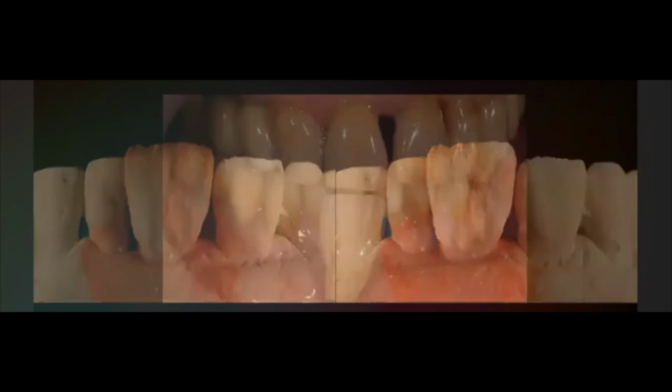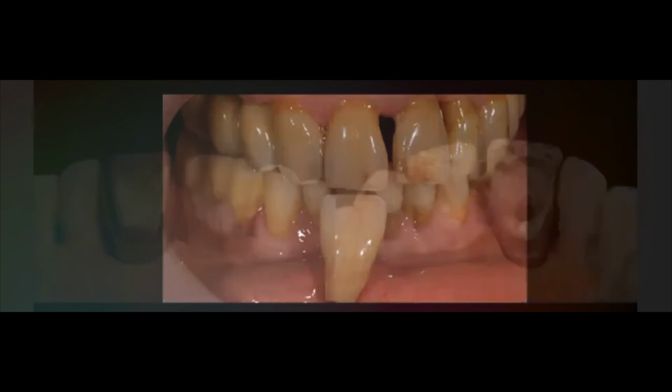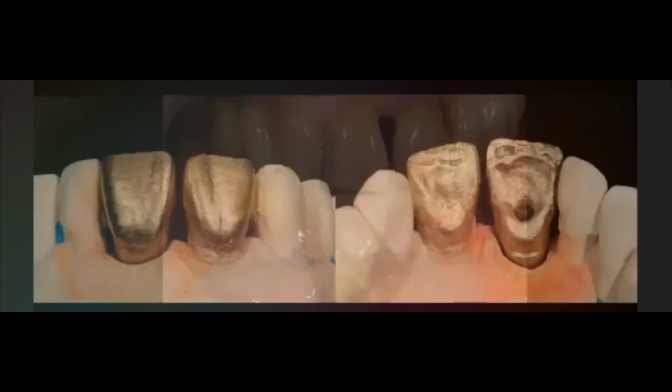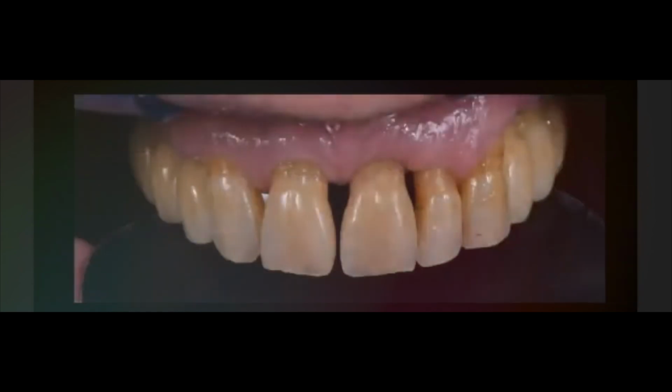And we bake the ceramic and then reduce, and we did some internal staining. Finally, we apply a second bake with lusters, and we finish the final morphology. And this is the final restoration. Really difficult details.